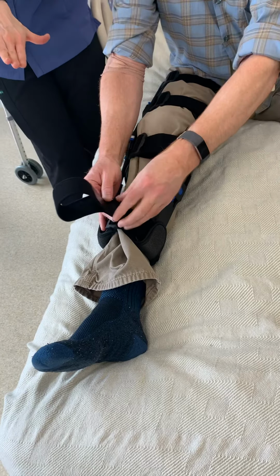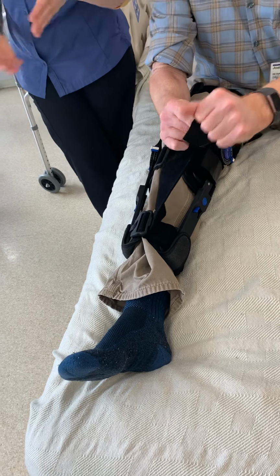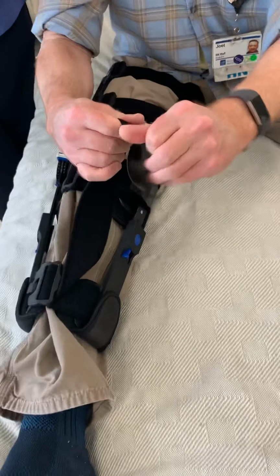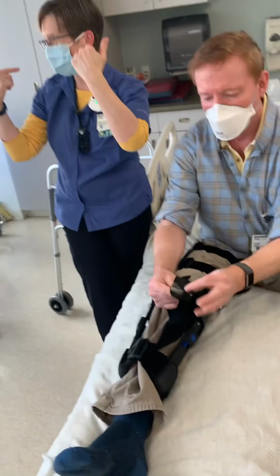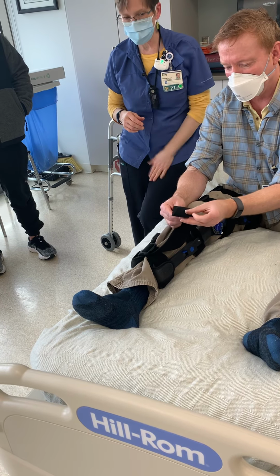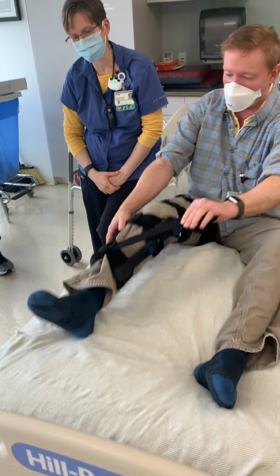So if you have to put one of these things on and it's looking like, my God, I'm wrapping this thing clear around, you can really do a lot of tailoring to it. And again, if you're not comfortable with doing all this fancy stuff with cutting the straps and readjusting all that, throw it our way. Not a problem. There's a lot of the braces that you can do that with. There's some of the shoulder braces you can do that with too. And as we all know, this Velcro is like NASA approved. I mean, it is.